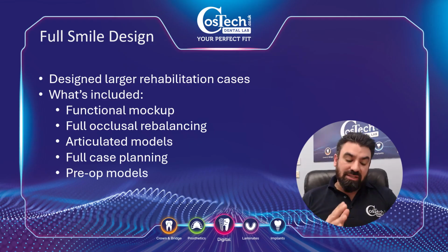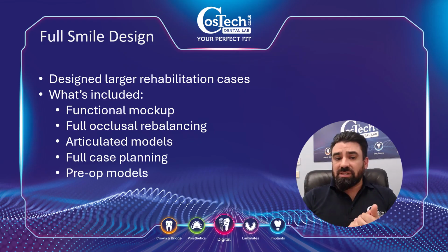What will happen is a technician will call you up and say, okay, what's the plan with this? These are what we can do. And sometimes you might come up with 1, 2, maybe 3 different options of what we can actually achieve. And also you get the pre-op models, so the patient can see exactly where they're starting and where they'll be finishing.